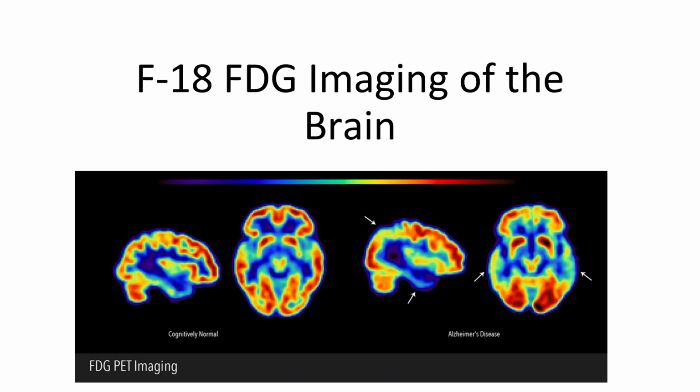One thing that I want to say before we start talking about FDG is that it is extremely important to get a good detailed history with FDG studies. It is also vitally important that the patients are prepped properly. If patients are looking at bright lights, listening to music, watching TV, playing on their phone, that affects the glucose metabolism in the brain.